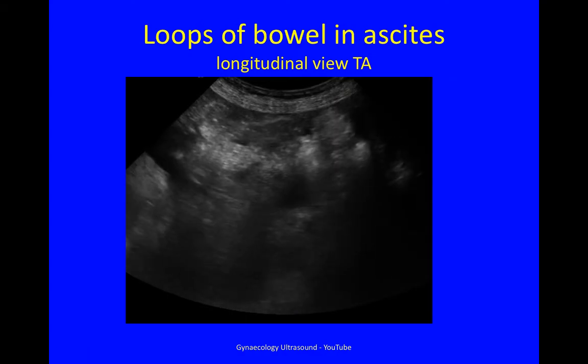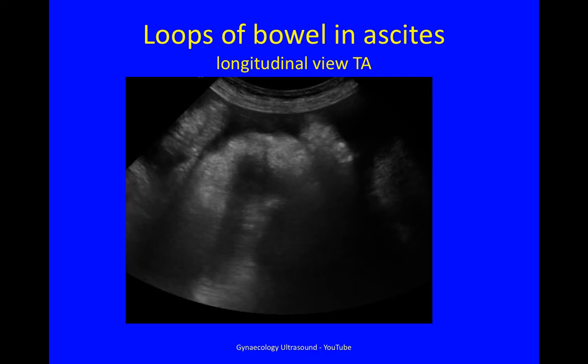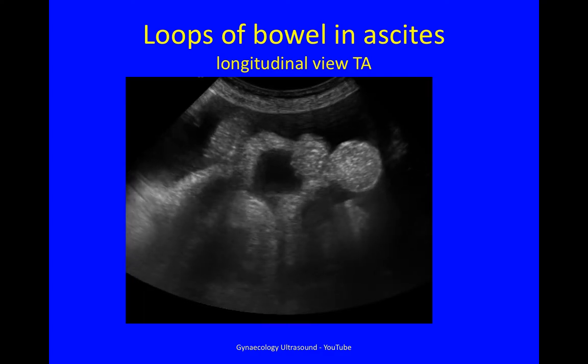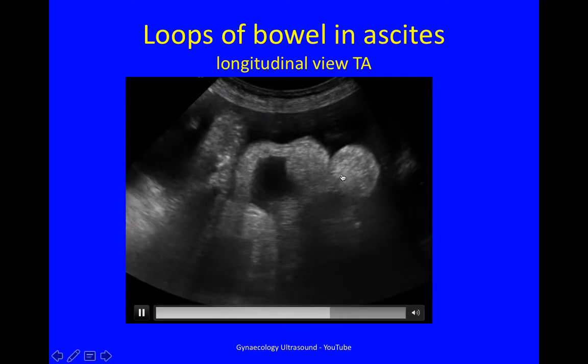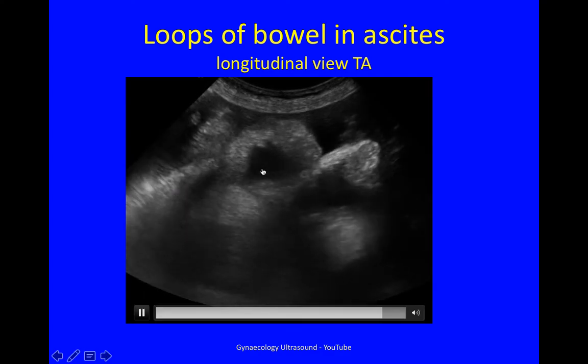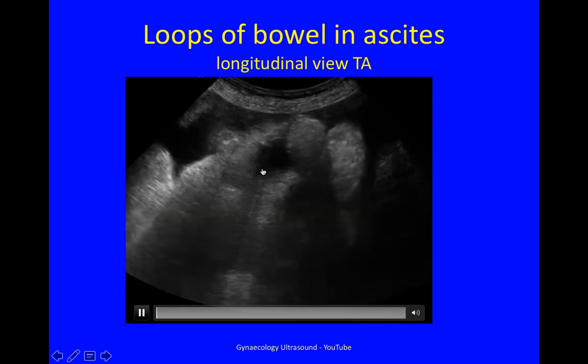Here again, longitudinal view, transabdominally in the epigastric region. You can see loops of small bowel on the mesentery, floating in ascites.